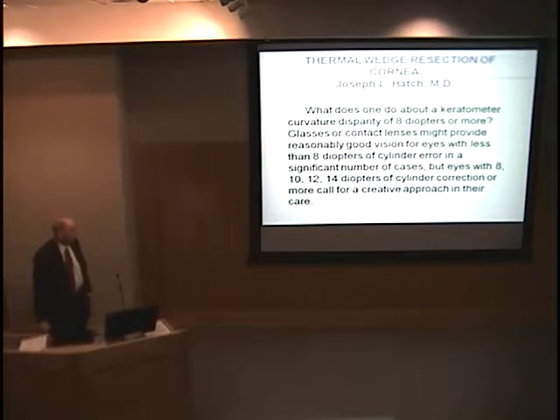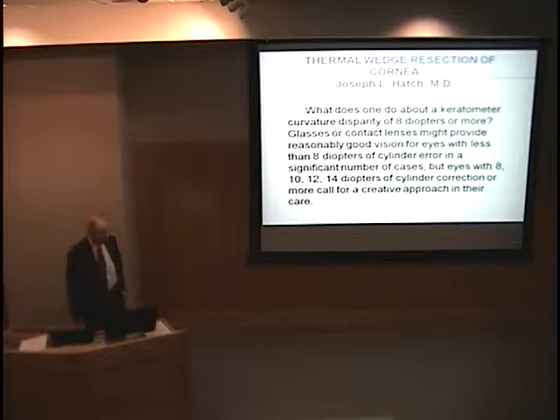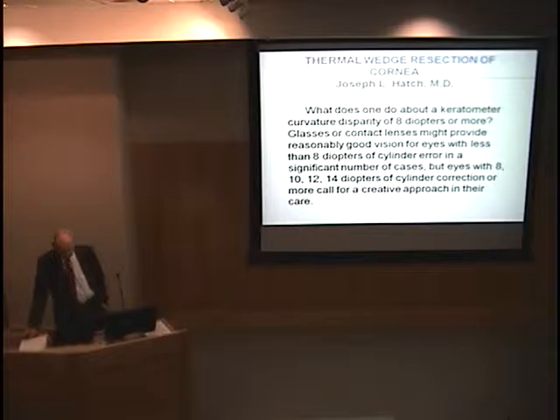What does one do about a keratometer curvature disparity of 8 diopters or more? Glasses or contact lenses might provide reasonably good vision for eyes with less than 8 diopters of cylinder in a significant number of cases, but eyes with 8, 10, 12, 14 diopters of cylinder correction or more call for a creative approach in their care.